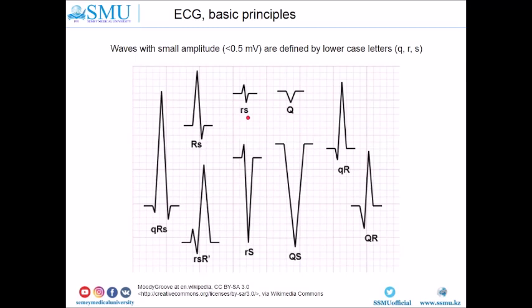A pathological Q-wave pattern is one where you don't have an R-wave or S-wave at all — only the Q-wave is found during assessment of the QRS complex. The small q, large R complex has a small Q and large R. The large Q, large R pattern is where the Q-wave is more than 5 mm and the height of the Q-wave is more than 25% of the R amplitude — this is a pathological Q-wave.